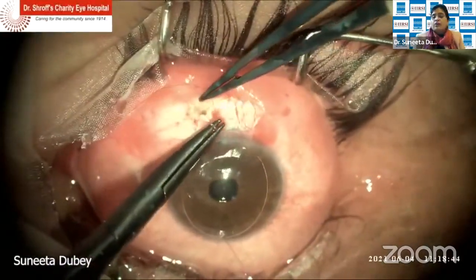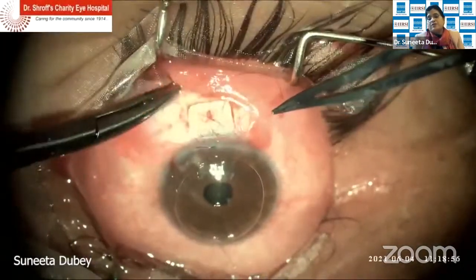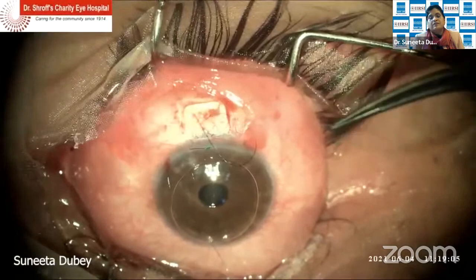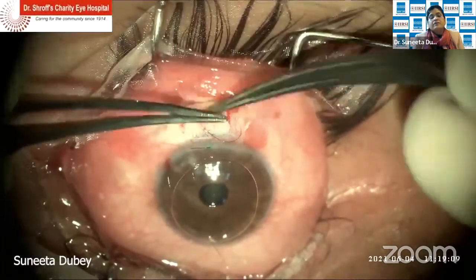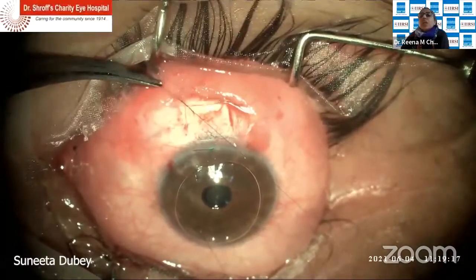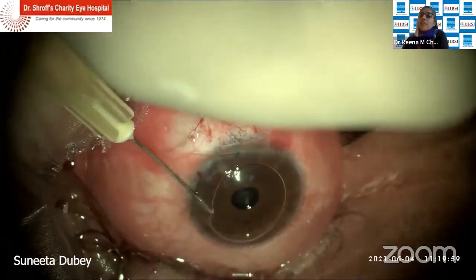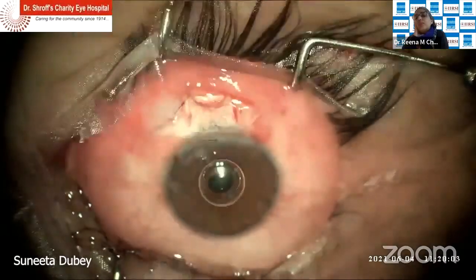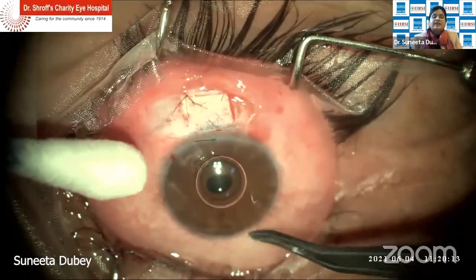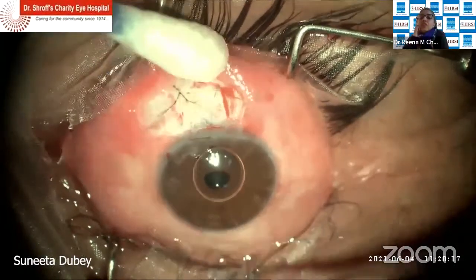So you can have multiple techniques of putting up releasable sutures. And I think all of us agree that we need releasable sutures in our trabs. They cause no harm, and you have safety. If you've used anti-metabolites, these releasables work very well up to 4 to 5 weeks. So now, titration, I think, how do you titrate your wound? That's a very good question.